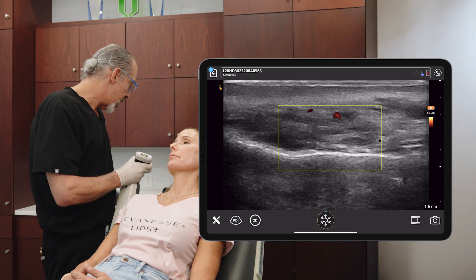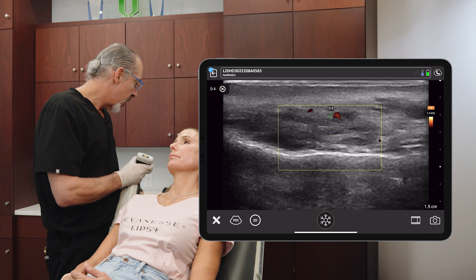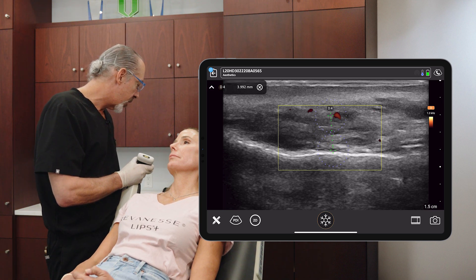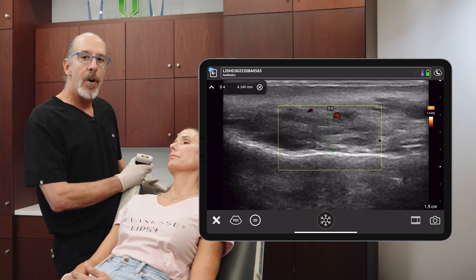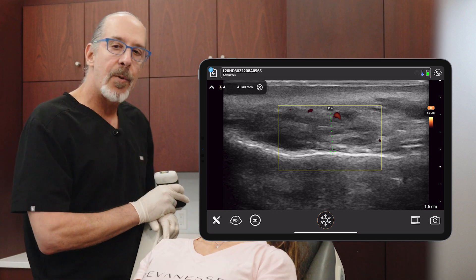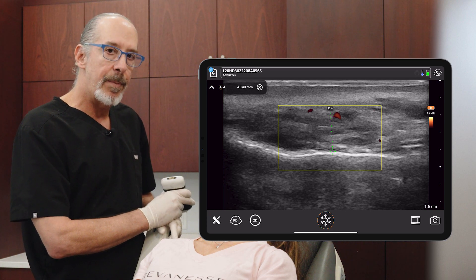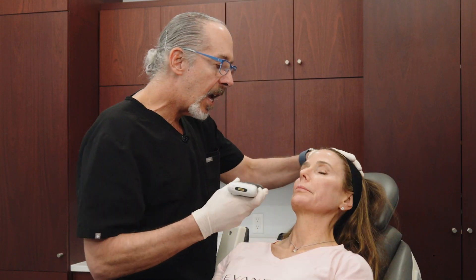This is obviously a lot more than that. I'll check the distance here — the bone is going to be hyperechoic, which is a very wide area. This distance is 4.14 millimeters. So it's very safe to inject deeply on this patient. Let's check out the other side.